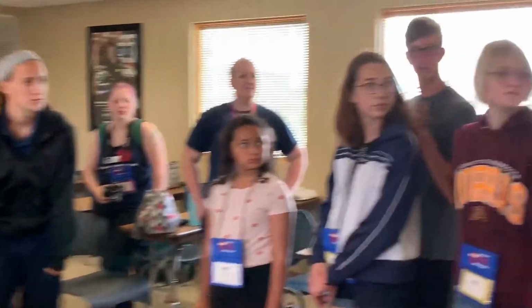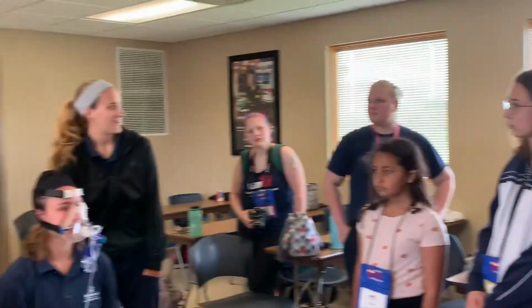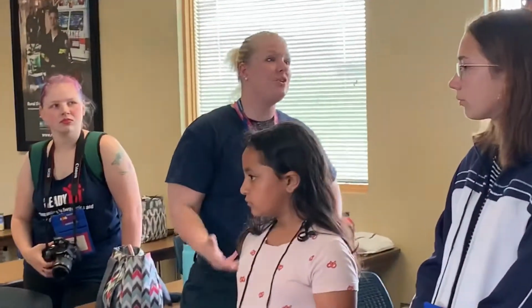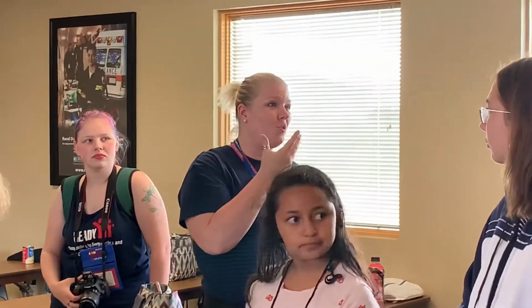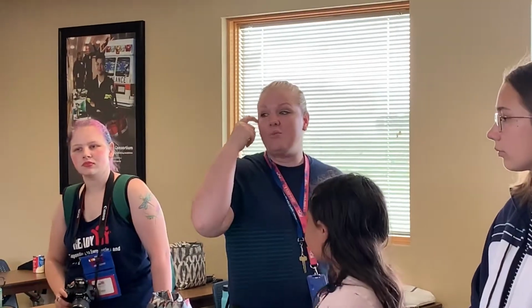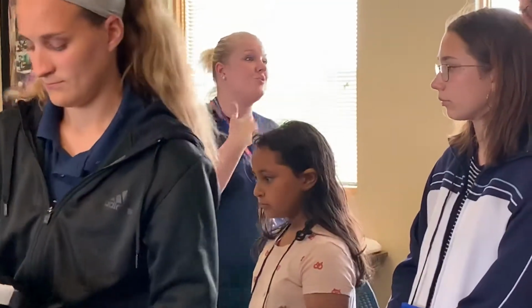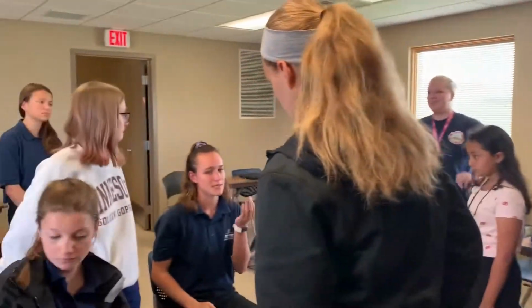Why don't you open your mouth while you're doing the C-PAP? I don't know. The air is being forced in, whether it's through the nose or the mouth. Usually if somebody is having difficulty breathing, they will probably be breathing more through their mouth. But they will see improvement within a minute or two. It's going to force the air in, whether it's through the nose or the mouth, so it really does a good job either way. The harder part is almost breathing out because you're pushing against everything. So you have to really focus on taking a deep breath and getting it all out.